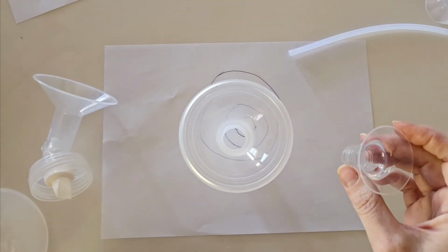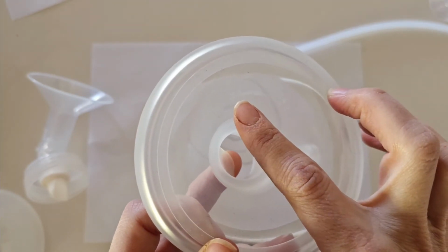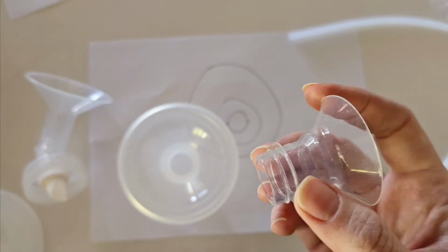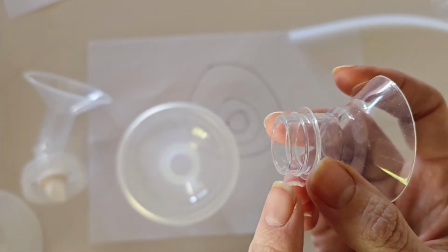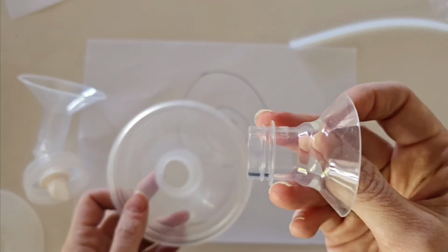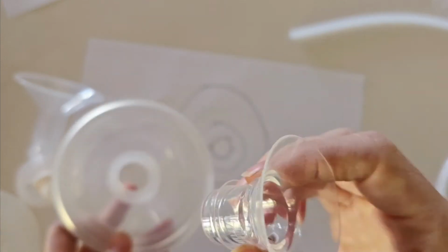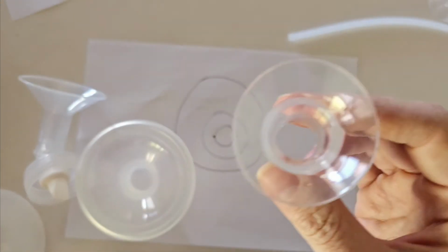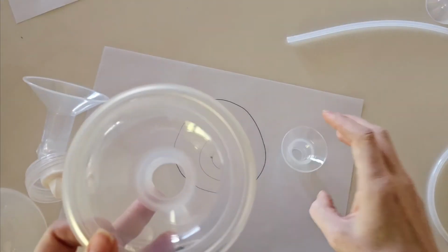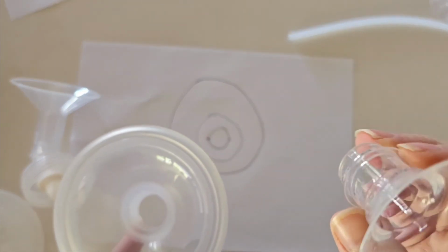The only other thing to also consider is if you do have a pump that has a standard 27 or 28 millimeter flange, you need to also make sure that your flange insert is also suitable for that larger flange size. So the base of this connects to the 24 millimeter. So if I was to put this flange insert specifically into a larger flange, then it would be too loose and fall out, because this is made to convert the 24 millimeter to a 17. So again, something just to keep in mind, that your flange size does matter, especially if you're trying to reduce it with a flange insert.